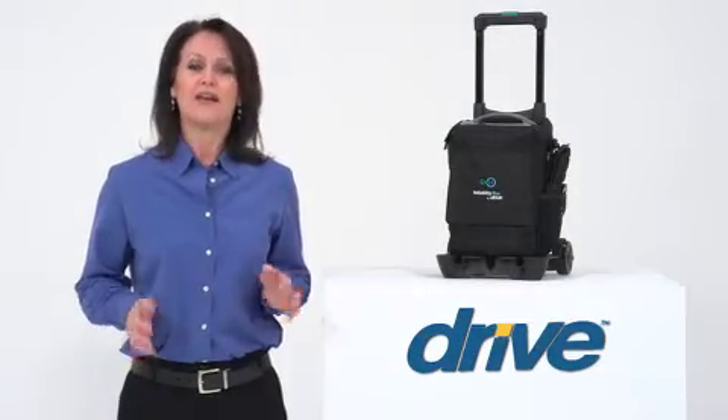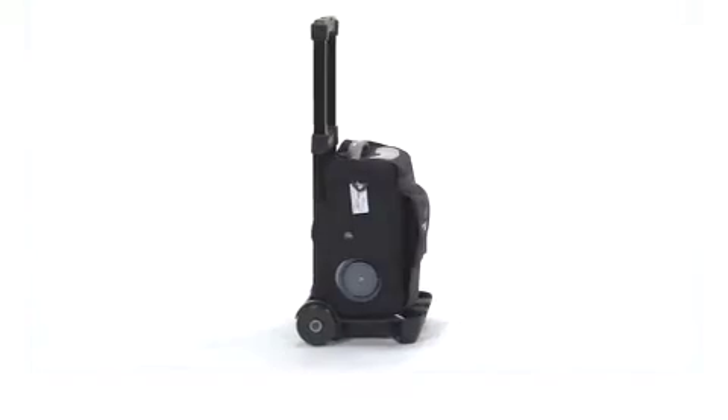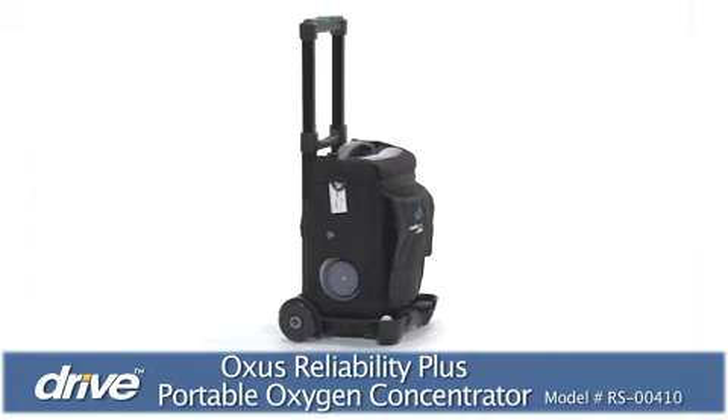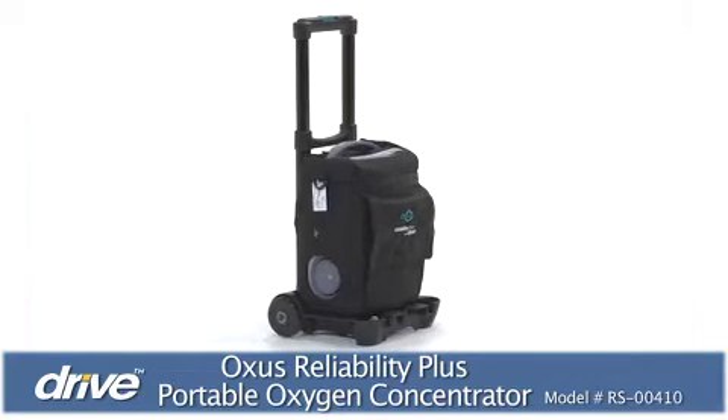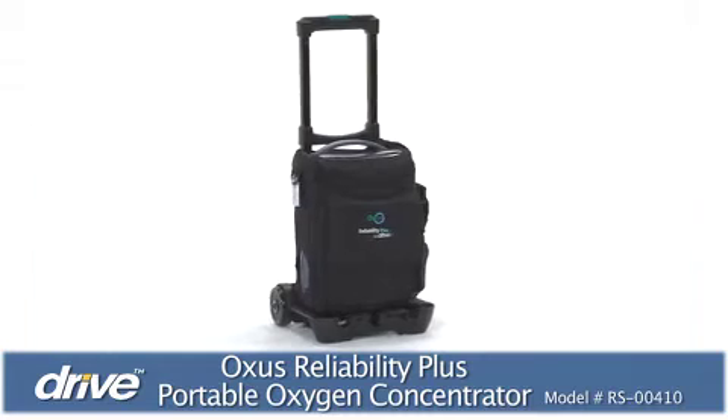When you have an active lifestyle, nothing should restrain your freedom, even when supplemental oxygen is part of your breathing treatment plan. Drive Medical's Oxus Reliability Plus Portable Oxygen Concentrator makes home confinement due to heavy equipment a thing of the past.